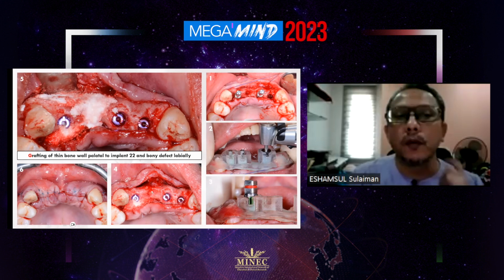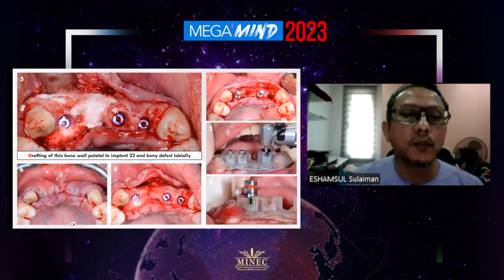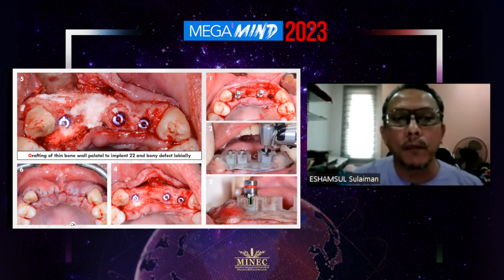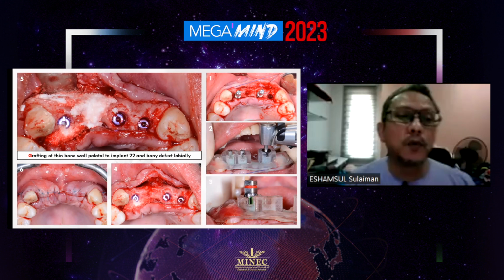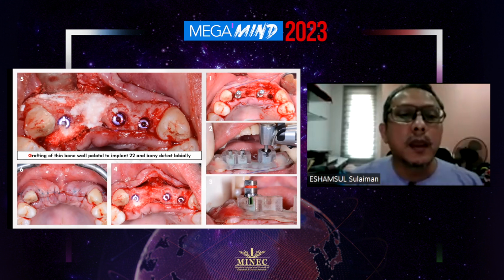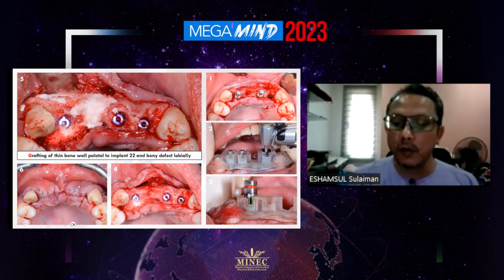Finally, where the threads of the implants were slightly exposed at the position of 1-2, and also over the crest where there was some concavity, and also on the facial sides, it was covered with synthetic bone. In this case, I used ETOS without a membrane. This was followed by primary closure using 5-0 sutures.